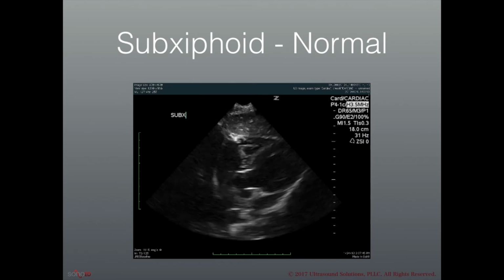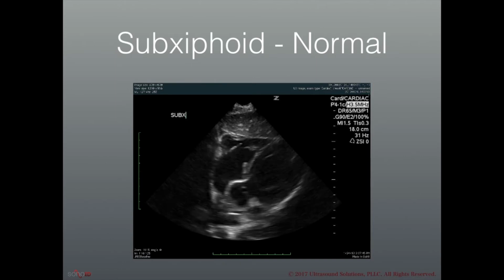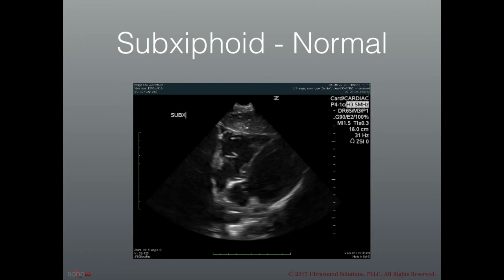Next, we want to look at the squeeze. The left ventricle looks like it's squeezing great. We'll talk more about that in a minute. And then strain, the right ventricle doesn't look enlarged, and again, we'll get into that more in depth in just a bit.